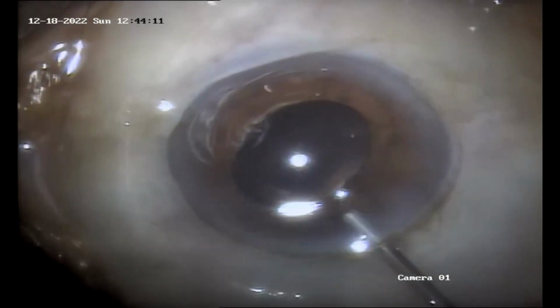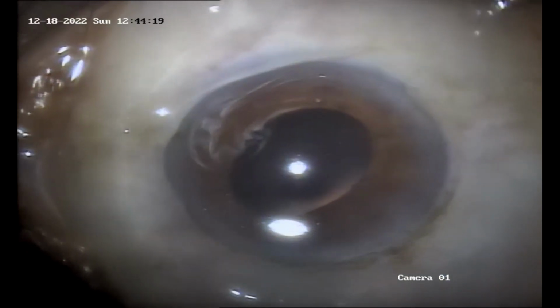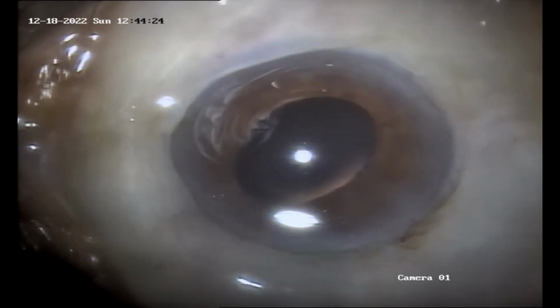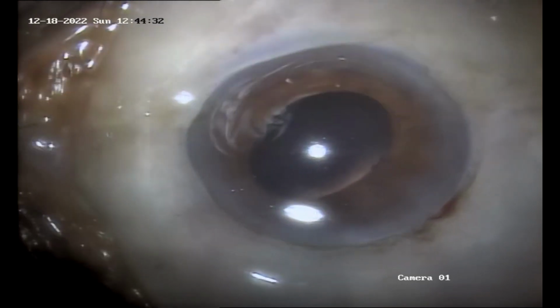The pupil is miosed, maybe because of a little bit of repeated manipulation by the phaco handpiece.